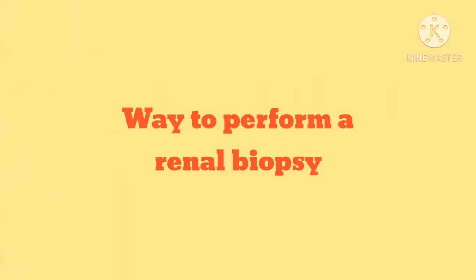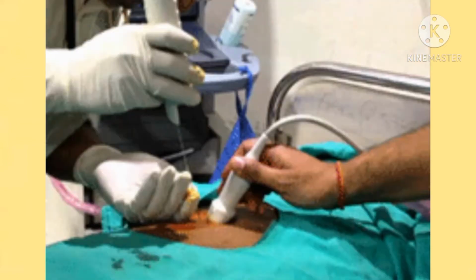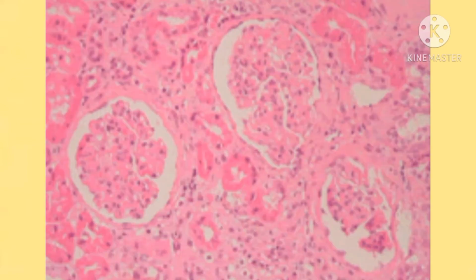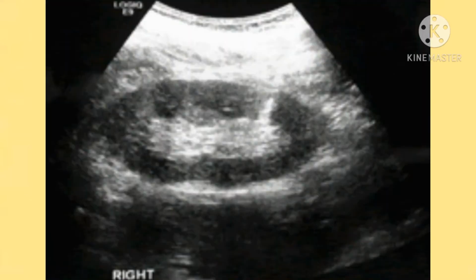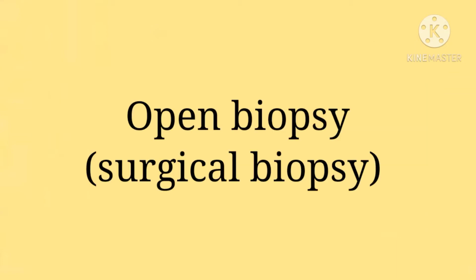There are two ways to perform a renal biopsy. The first one is percutaneous biopsy, or renal needle biopsy. For this procedure, a doctor inserts a thin biopsy needle through the skin to remove your kidney tissue. They may use an ultrasound or CT scan to direct the needle to a specific area of the kidney.